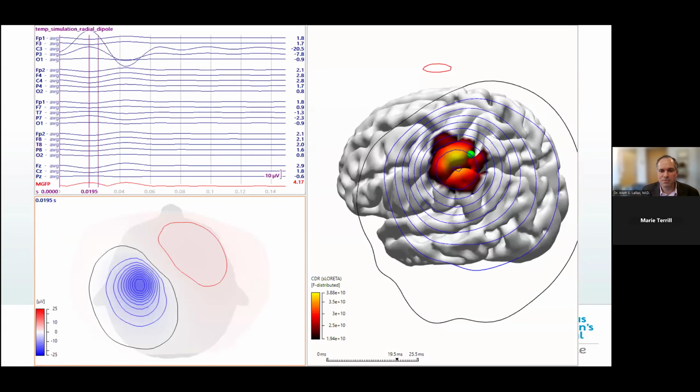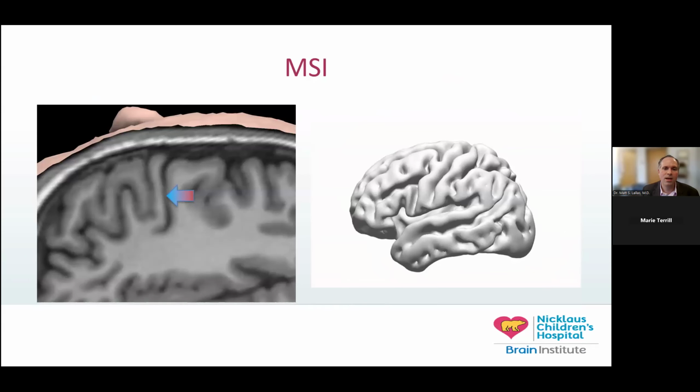And what I was skipping to a moment ago was the idea that MEG is a related technology where what we're seeing instead is the magnetic fields. And really the magnetic fields across the sulci tangentially on the bank, rather than at the crown of the gyrus, are the ones that are visible to the recording devices of the MEG. And as a result, if you've got signals on both sides of the sulcus that cancel out, you might not see that. But if you have an unopposed signal at a sulcus, you can see that pretty well.